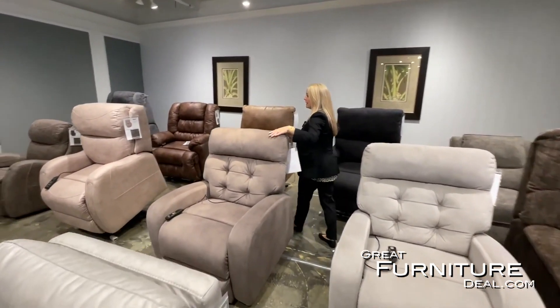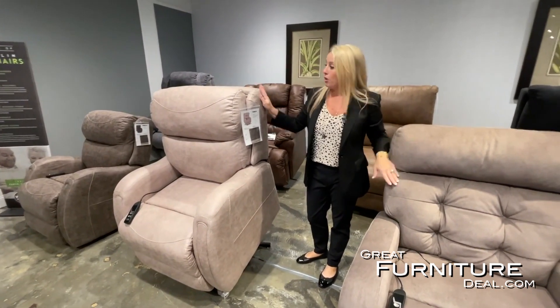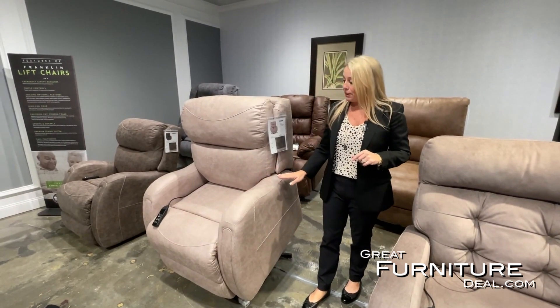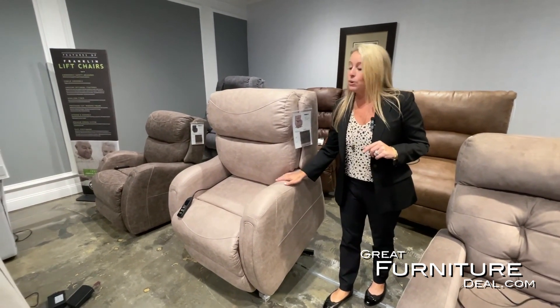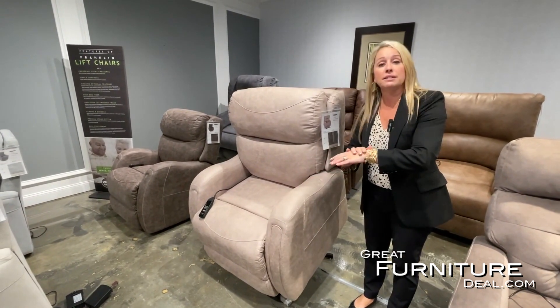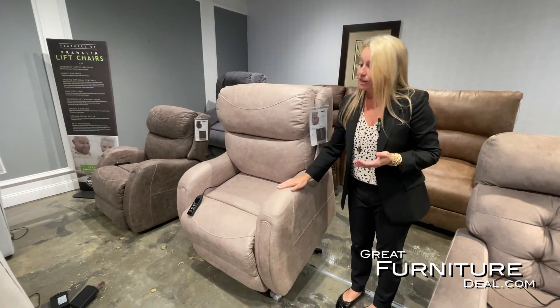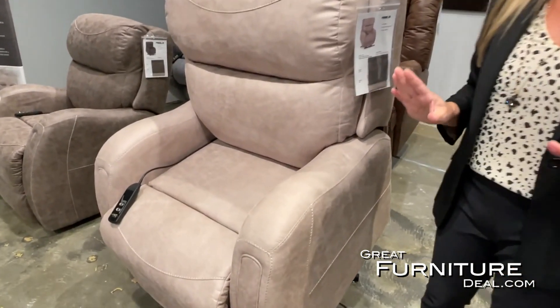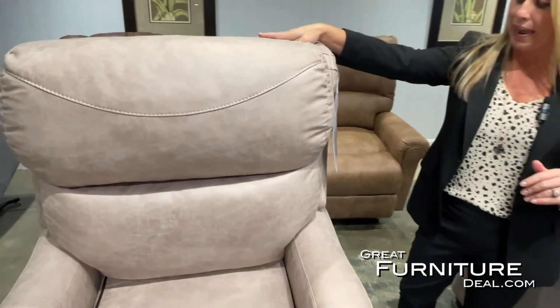The first thing I noticed about the Franklin lift chairs is the fabric. All of these fabrics have been pre-selected for durability, number one, because a lot of folks need to live in these chairs. But the other thing is softness. Someone who might need a lift chair is going to need as soft a fabric as possible, because skin over time can tear or bruise. Our entire line is pre-selected for that use.